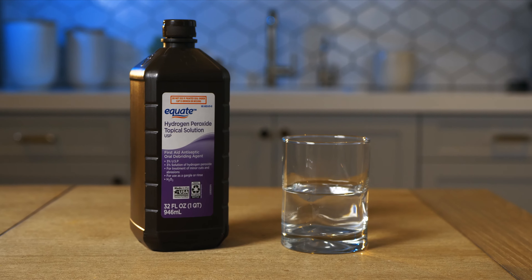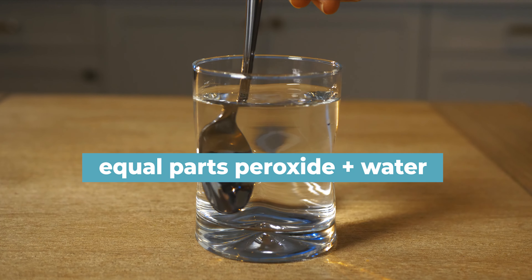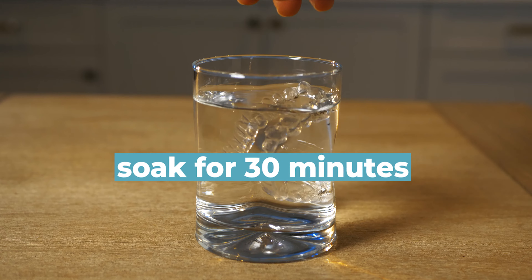The third method is peroxide and water. Use equal parts hydrogen peroxide and warm water, and soak for 30 minutes.